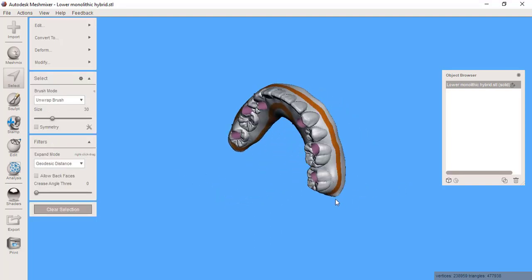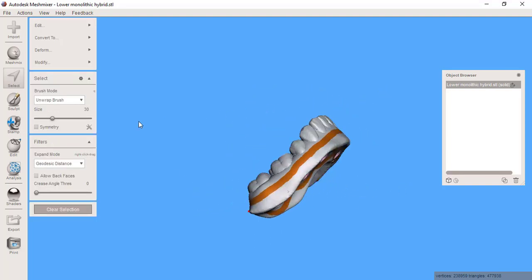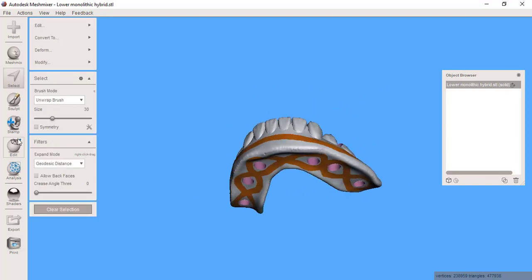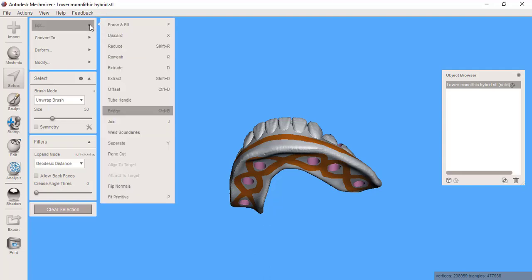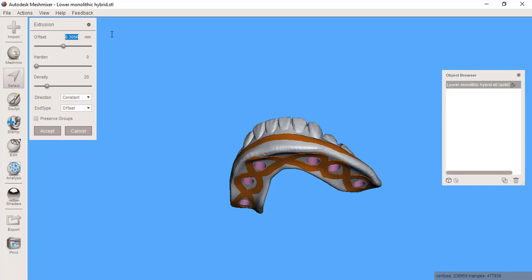You can see this is where I want to create the channels. Now the last step is I'm going to go to edit extrude, but I don't want to extrude outward. Rather, I want to create a channel inward. So I'm going to take the offset and go to negative two and see what it looks like.